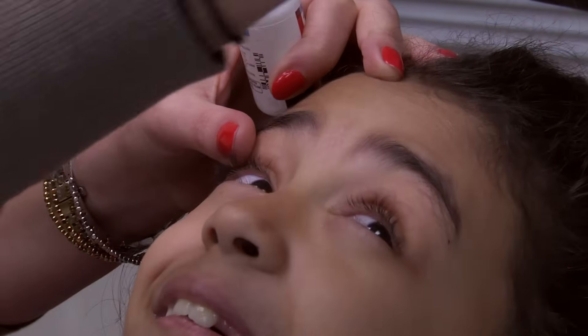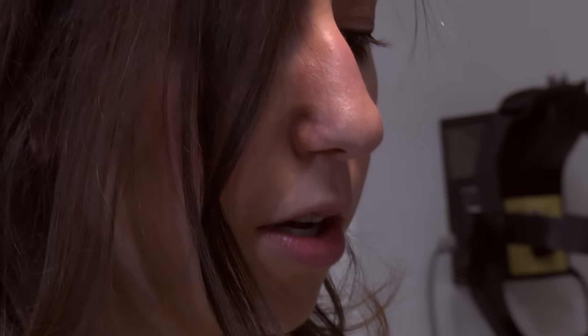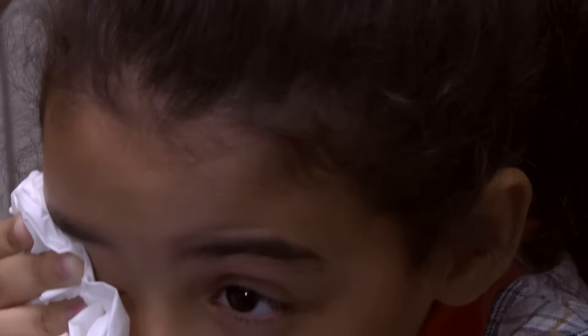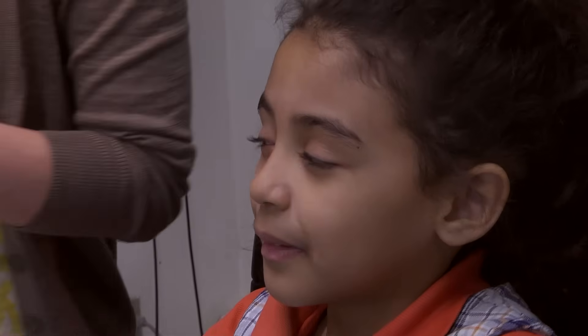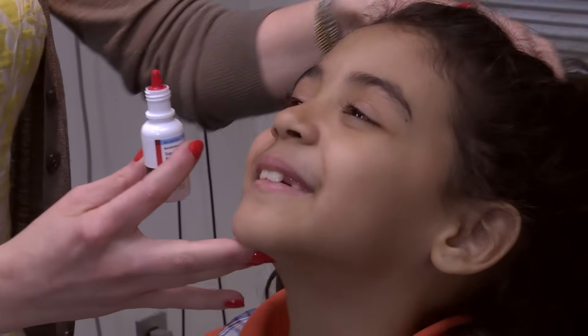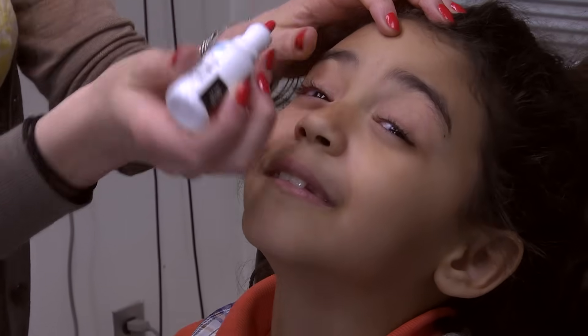After this comes the dilating drops. There are two drops that are commonly used that will dilate the eyes, making the pupils larger so that we can get a good look at the back of the eye. It will also make the child blurry at near for a few hours after. This is a very important step — often in children, the focusing system is very strong, so the prescription can sometimes change once the drops are in the eyes.